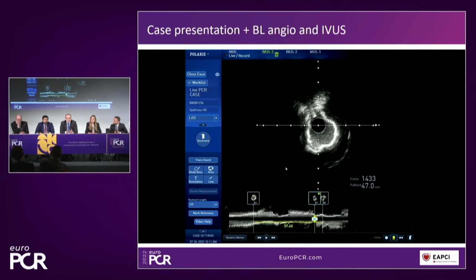I guess as to the indication for bypass surgery, this has been discussed locally by the colleagues. This was a patient brought in with out-of-hospital cardiac arrest, has been intervened upon on the circumflex. So it's not the kind of patient that cardiac surgeons would like to operate on right away, at least at my place. But certainly the question on the sizing of the plaque modification devices based on IVUS, now that we've got this information, is a valuable one.